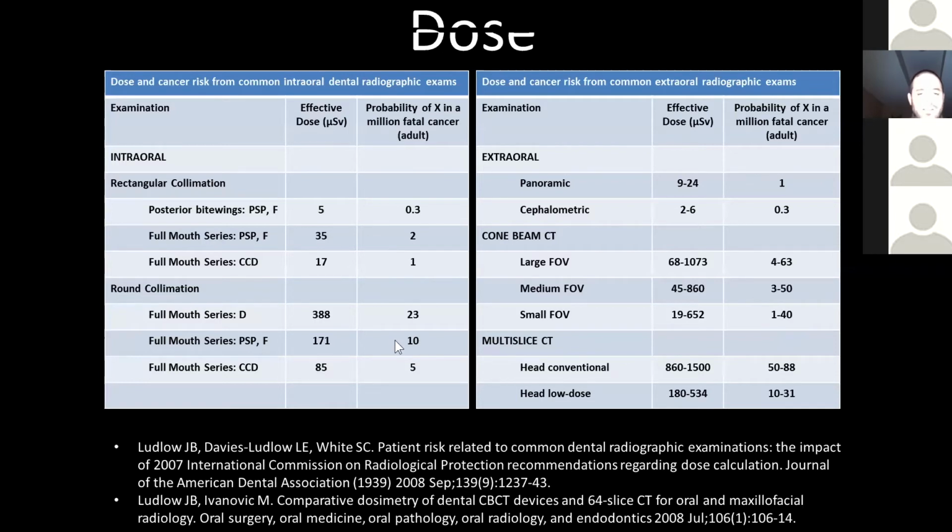Now, this is useful for us as professionals to think about the numbers. It's a rare patient who wants to hear that, oh yes, patient, your pan today will give you a 1 in a million chance of acquiring a cancer. I know these numbers and I still don't want to hear that. What you need to start to think is a comparative risk rather than an ultimate risk.